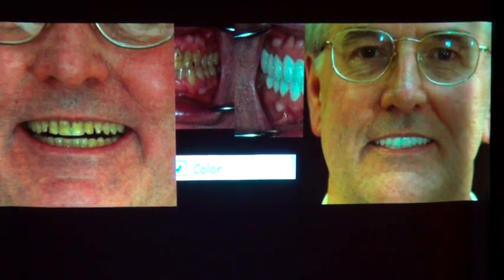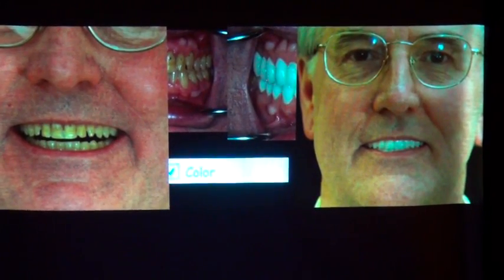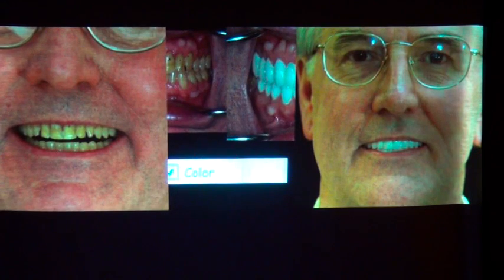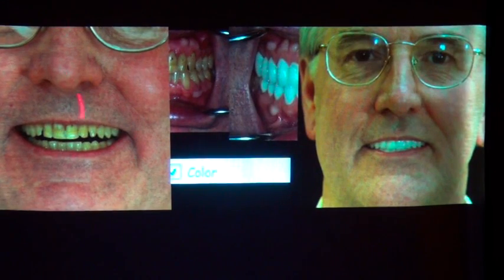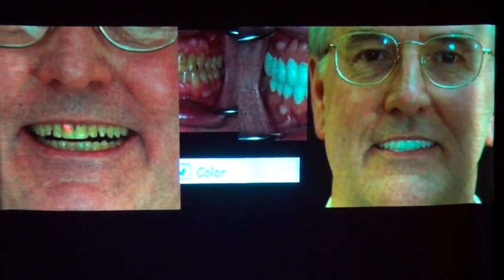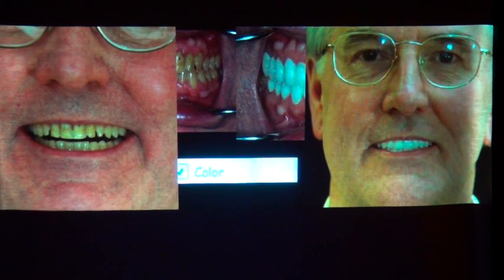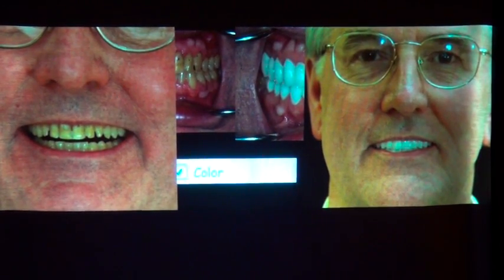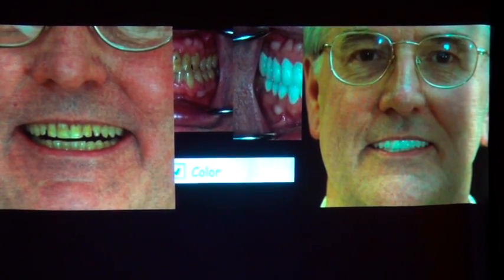Now this patient, the color of his teeth was pretty yellow. And it looks like, okay, what do I need digital smile design for that? All I got to do is replace the teeth with white teeth. But here it becomes very important because what he has here, and his midline is off a bit, is that you want to make sure that you give him back nice straight teeth and an incisal plane that matches what he had. So you need to be cognizant of digital smile design there, so you can give him what he came in with, as far as the incisor position, and the length of his teeth.